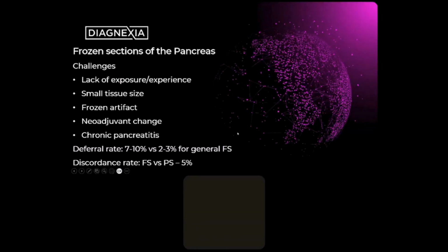Okay, so let's shift gears slightly. We've got just a few minutes to do frozen sections of the pancreas. This is challenging, and I was fortunate enough to work in a center where we had pancreatic frozen sections almost every day, and therefore you develop the experience and the expertise because you are exposed to it. And I think that's a very important aspect to dealing with frozen sections of the pancreas. If you do one every 5 years, don't do it. Get somebody else to do it. Otherwise, you're putting yourself in an invidious position.